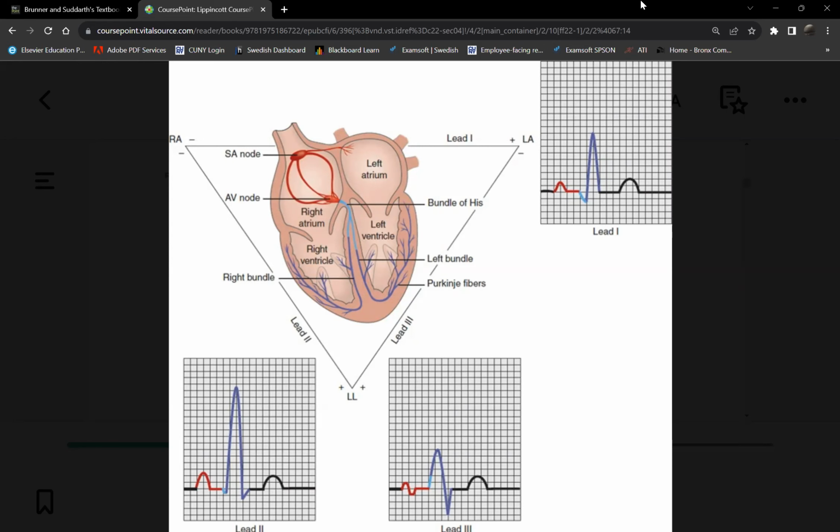Okay, so they only put 5 leads, correct? Yeah. On a portable box. Okay, so there are only 5 leads there. That is a limited view. Because it only has 5 leads, the most you'll see there is between 3 to 6 leads only, or 3 to 6 views. A 12-lead ECG has 10 leads or 10 electrodes, giving you 12 views.